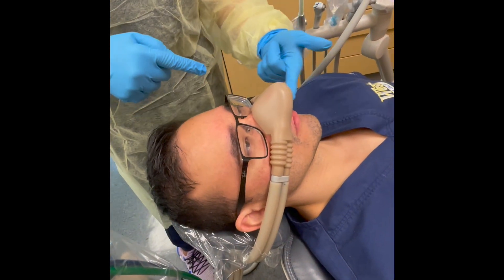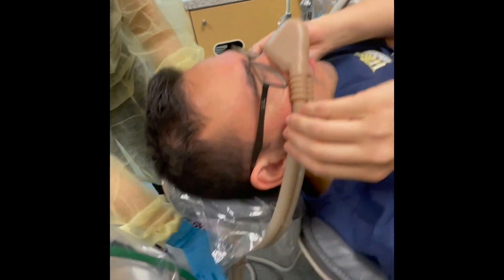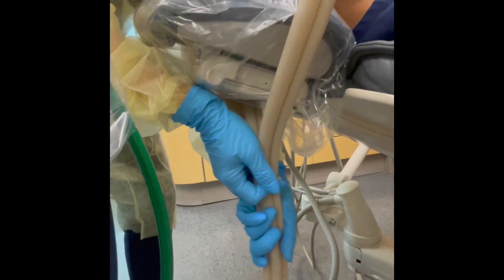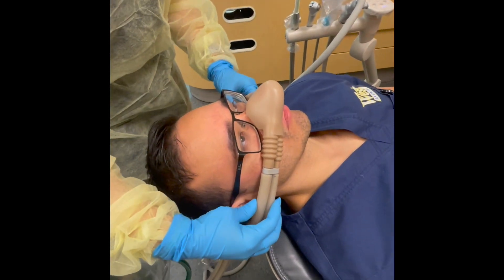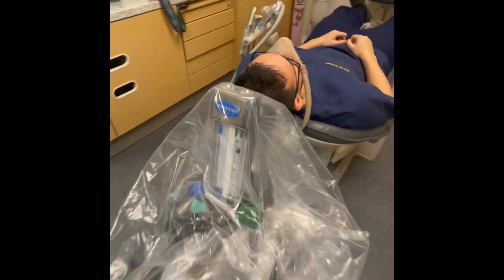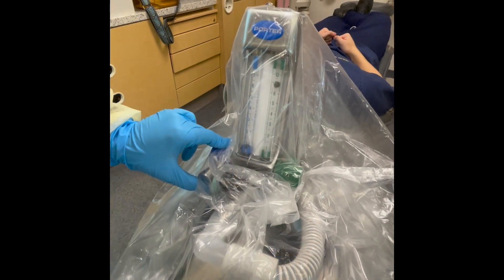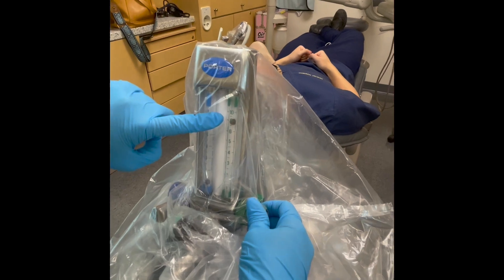Secure the nasal hood over the patient's nose making sure there are no gaps — it should be flush against their face. Allow them to adjust it if necessary. Ask them to breathe through their nose and ask them to let you know if they feel they are getting enough oxygen, and observe the reservoir bag. In this case, my patient needs more so I increase the flow to 7 liters per minute, then 8 liters per minute. Remember, everyone has a different lung capacity. His tidal volume is 8 liters per minute.